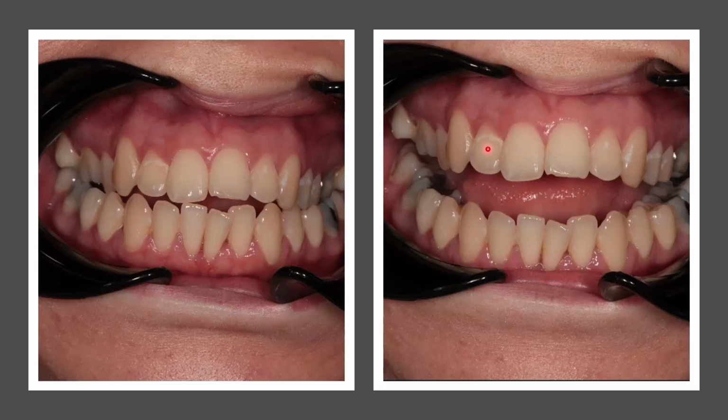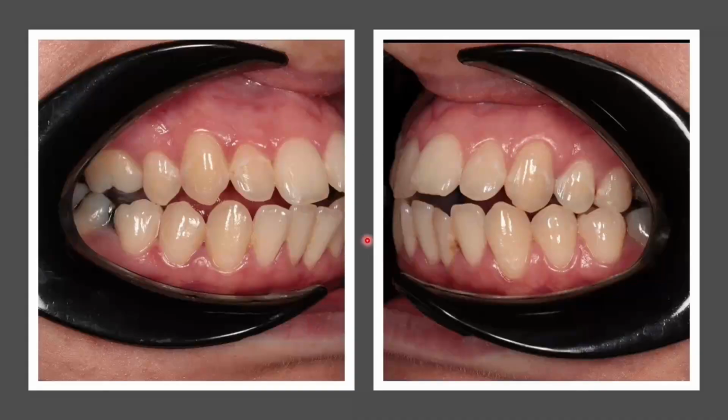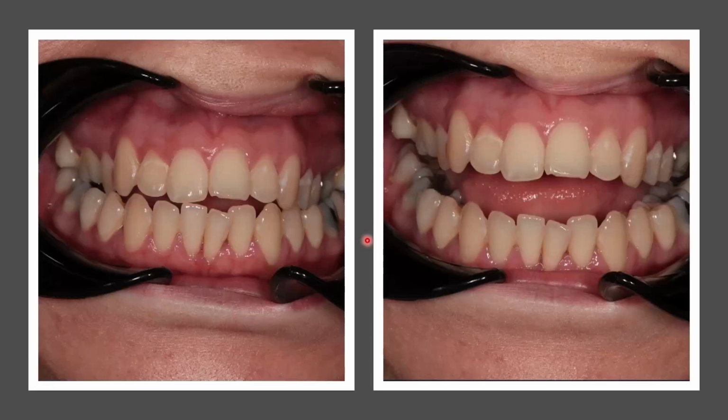When we look about simplifying a case, we are looking at it visually and saying, is there any way we can line this up to make that smile look better? So the buccal corridors here are really quite dark and narrow. We've got this tooth here seems to be the big issue, but it is a relatively simple movement to push that down with a tip. On the lowers, it's a slightly harder move to upright this. It is slightly harder, but not impossible.